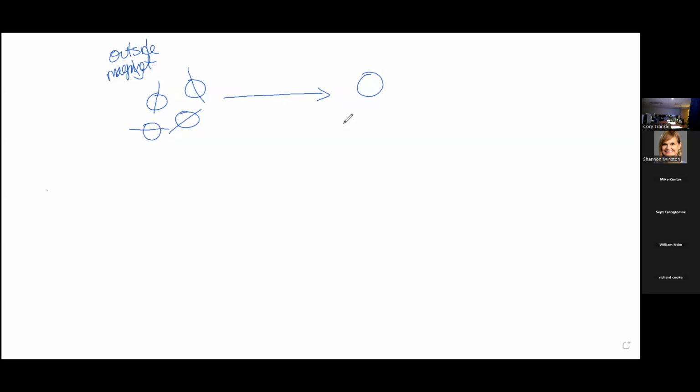So strong. No. Well, one reason, if you ever go into an MRI environment, there are all these signs, right? They talk to you about the magnetic field and all that kind of thing. Well, one issue, what happens if we just think about an MRI scanner, it's this round device with this hole in the middle, right? Let's put our MRI scanner over here.